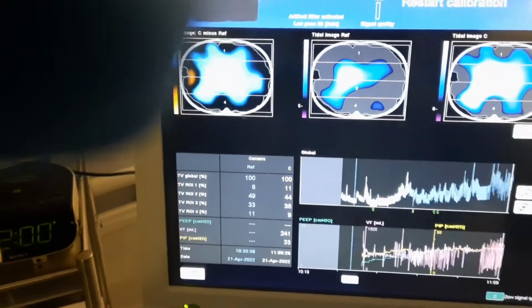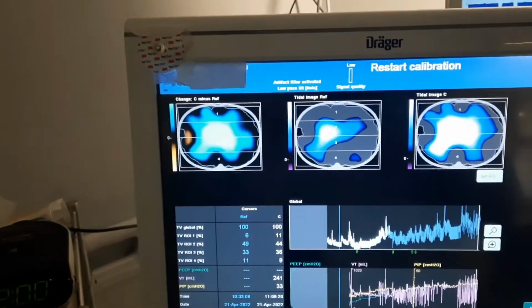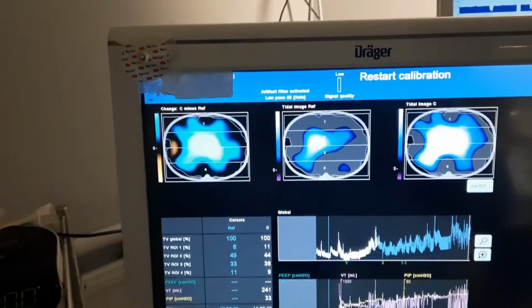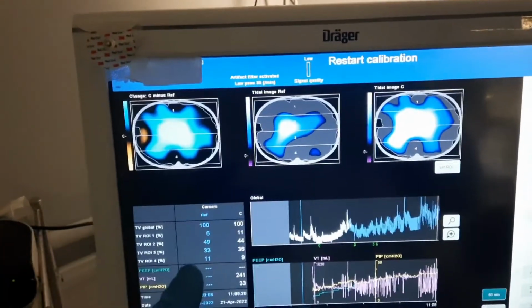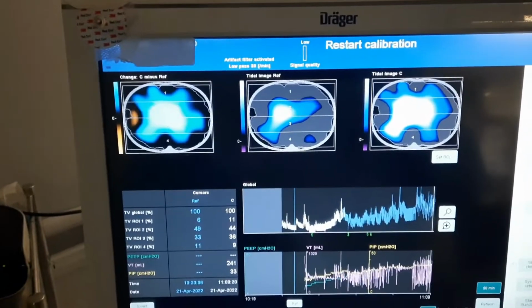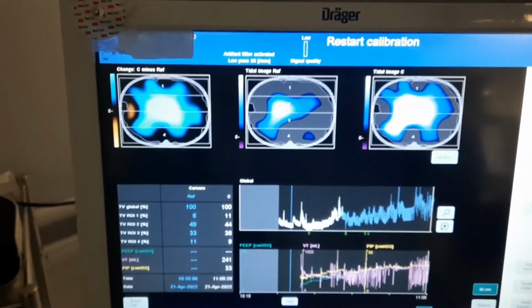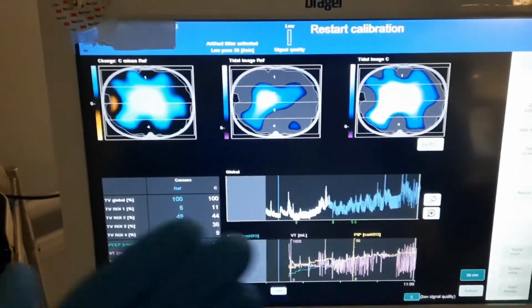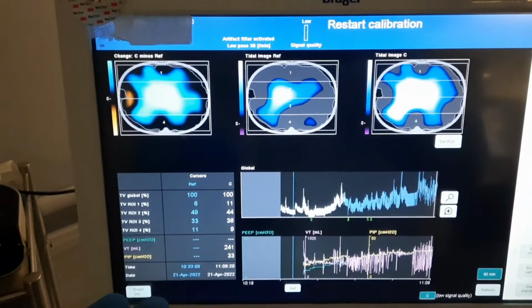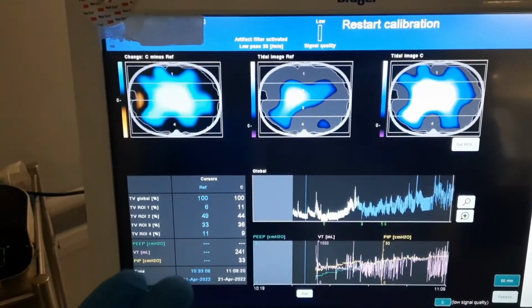pressure support of 6. The thing is, with conventional ventilation, you have the ability to recruit with pressure, but you're very limited in time because in conventional modes the inspiratory time is maybe 1 second. And if recruitment is pressure over time, we're limited in conventional ventilation by the inspiratory time setting.